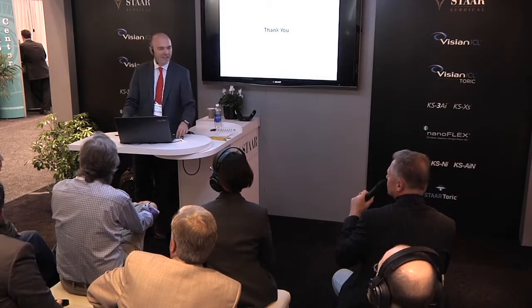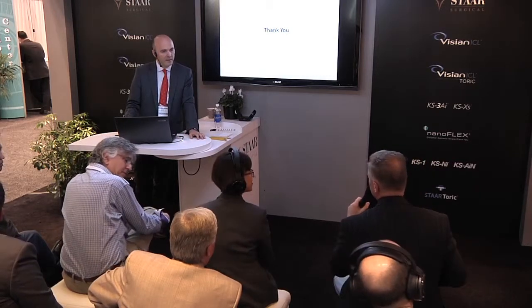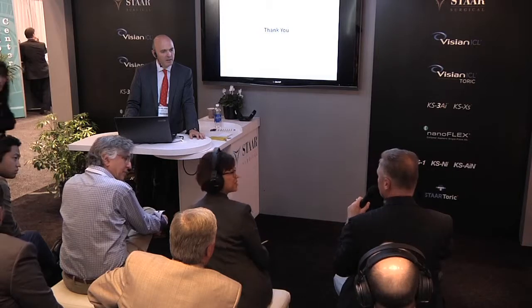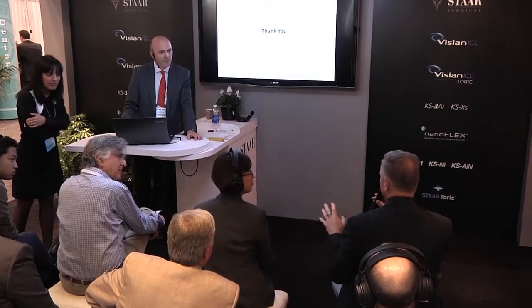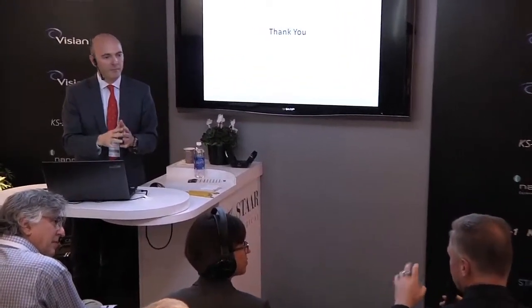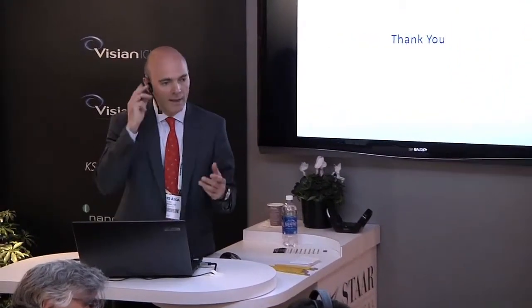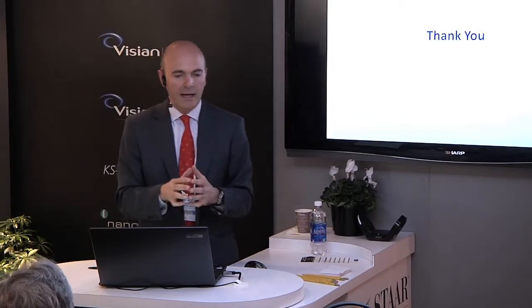Yeah, and the second part of the question is that, as I can understand, the UBM is good for measurement, but you cannot count on the UBM software to size the ICL. So I have to measure it by UBM and then either use your formula or use a normal calculator. All right, that's right. I mean, the Compact Touch has ICL simulation software, but I wanted to make it very clear that what I've been doing has nothing to do with that.